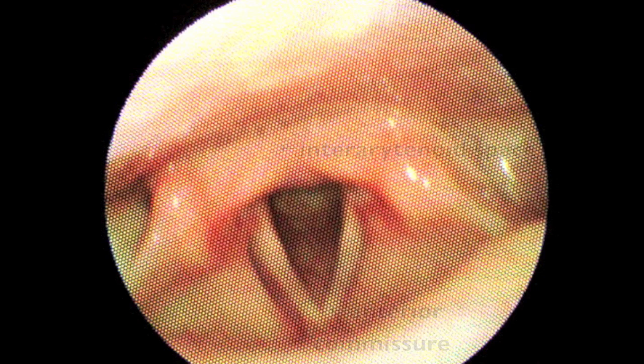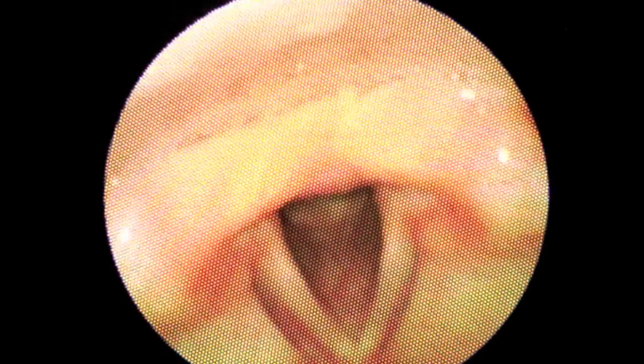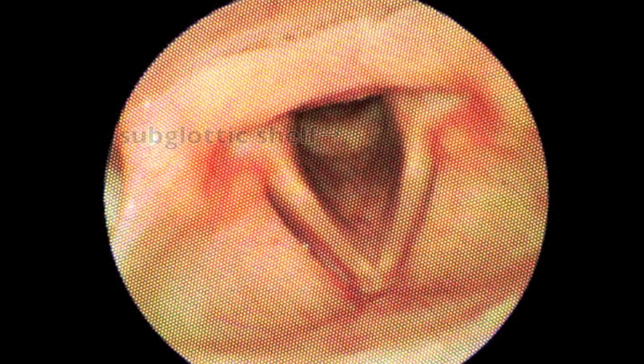By continuing to advance the endoscope to the post-swallow position, you will be able to observe the anterior trachea and the subglottic shelf.